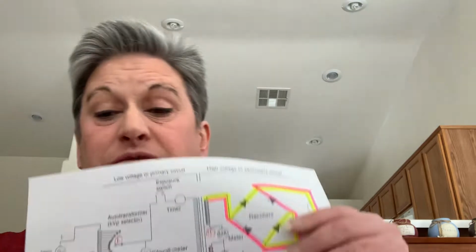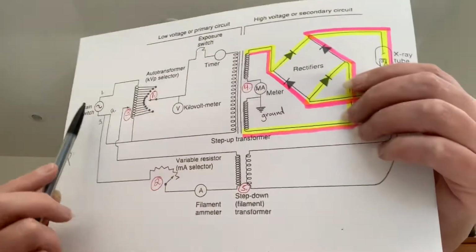Then there's a transformer outside the house or the building that converts that 220 volts to 110 volts before it goes inside the house or the building. The 110 volts enter the X-ray circuit. Once in the circuit, the electricity will flow in 3 lines. And I have them diagrammed here.